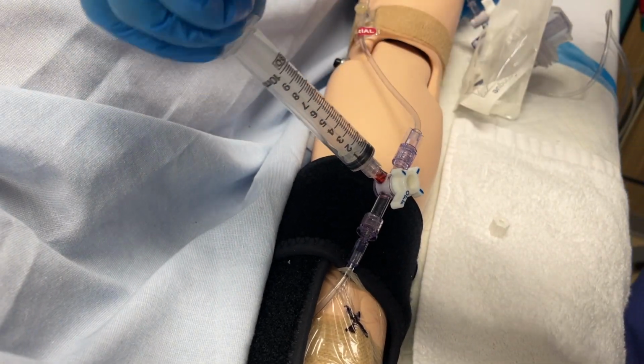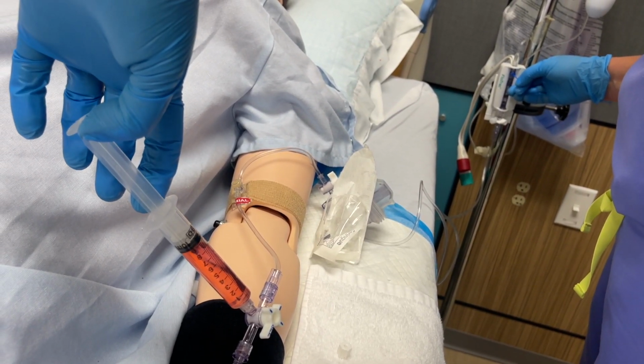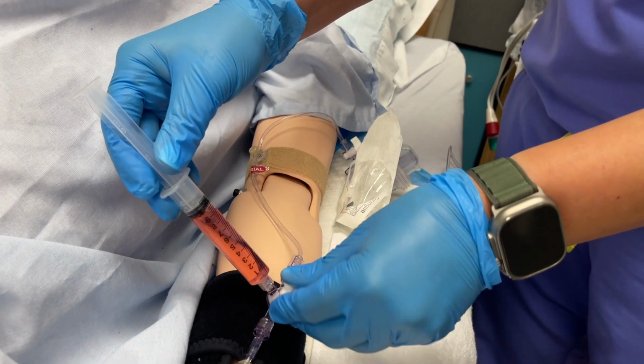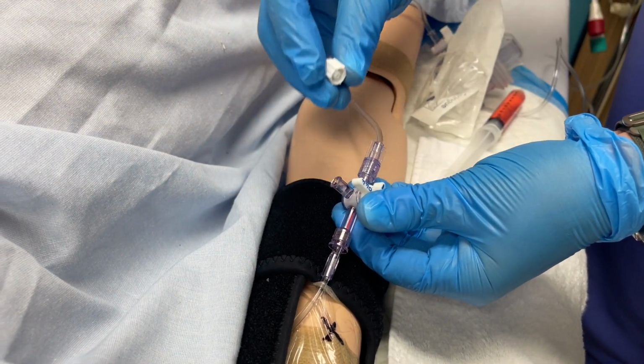Then simultaneously pull on the pigtail engaging the flush and gently pull back on the plunger of the syringe. This pulls the flush from the line into the syringe, including the blood from the port. Once the port is completely clean, disconnect your syringe and turn the stopcock back off to the air. You should be able to resume hemodynamic monitoring at this point.